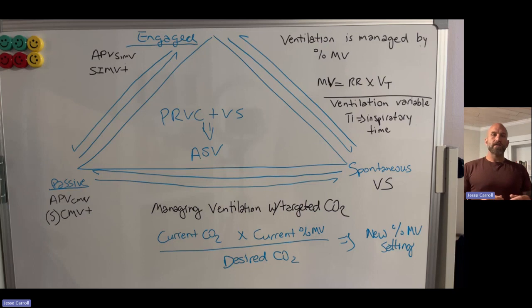Whereas, in contrast, traditionally in conventional styles of ventilation, when we allow patients to breathe spontaneously, take your SIMV with pressure supports, that's exactly what's happening. Those spontaneous breaths are being given with a set pressure support. This could become problematic over a period of time, especially if the patient has any sort of active, either acute or chronic lung condition that they may be faced with.